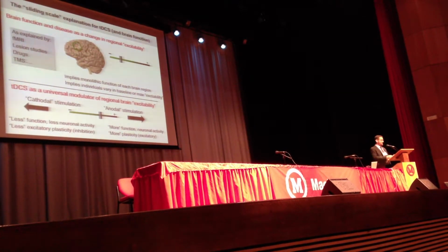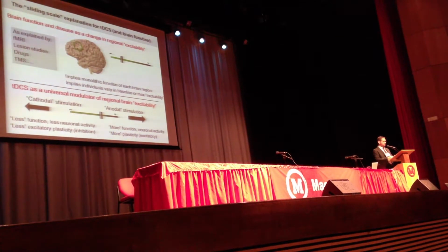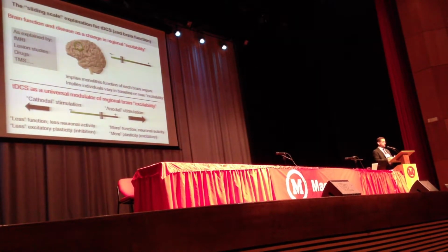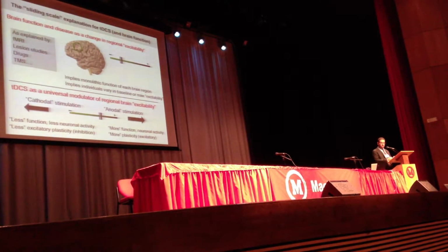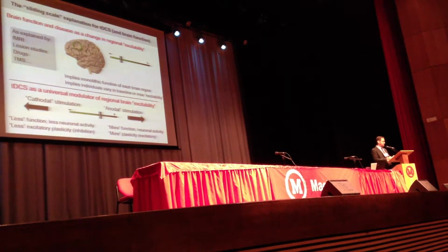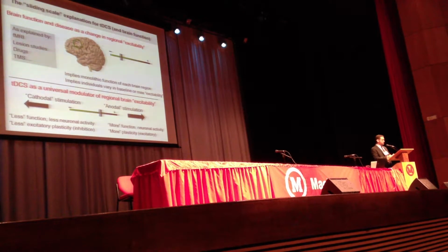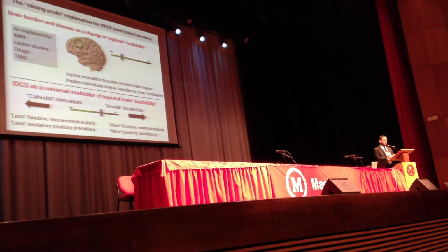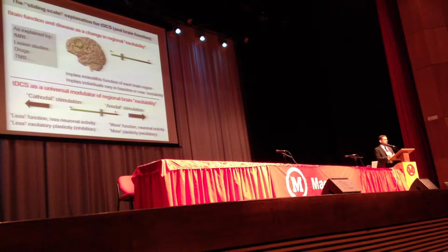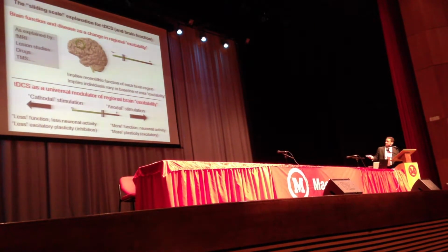This idea of a sliding scale and anodal-cathodal has been extended to many studies in tDCS to rationalize them, including for cognitive performance in healthy adults. An important question to think about is, does this make sense? What studies have we done as a community to support this idea? And is there a way we can be more sophisticated, where we can approach both brain function and tDCS in a way that is more subtle and produces better results?